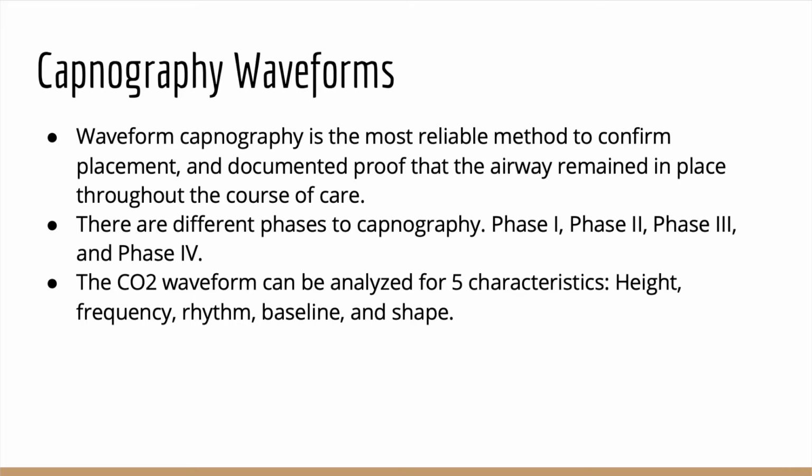So phase 1 is the beginning of exhalation or baseline, and there is no carbon dioxide present. In this phase, no gas exchange occurs, hence is why it's called dead space. In phase 2, carbon dioxide from the lungs reaches the upper airway and mixes with dead space air, which causes a rapid increase in CO2. Carbon dioxide is detected using capnogram in exhaled air. It is also called an ascending phase or early exhalation.